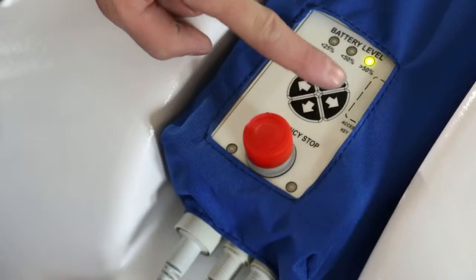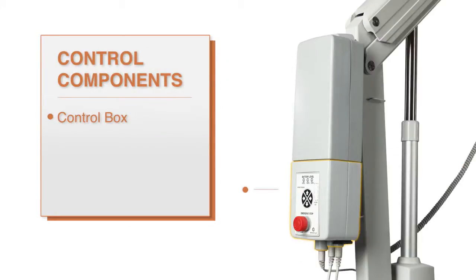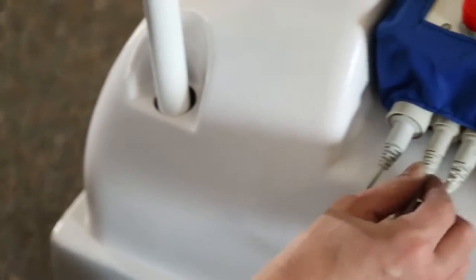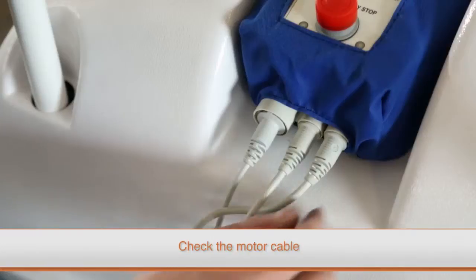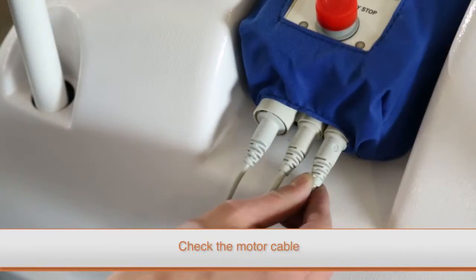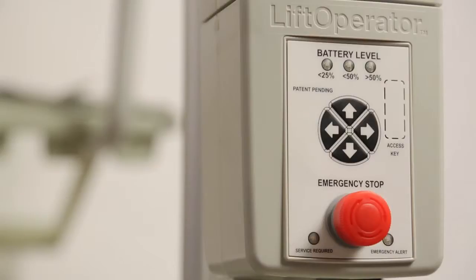If your lift does not move left or right, you may have a problem with either the motor assembly, the control box, or the cable that connects them. First, check the cable that runs from the motor assembly to the control box. If it is pinched or damaged in any way, you will need to replace it and the control box. If the cable appears to be in good condition, you can move on to testing the control box.